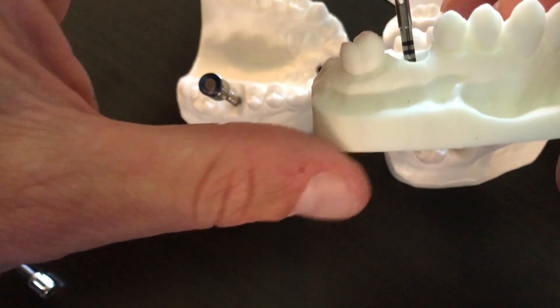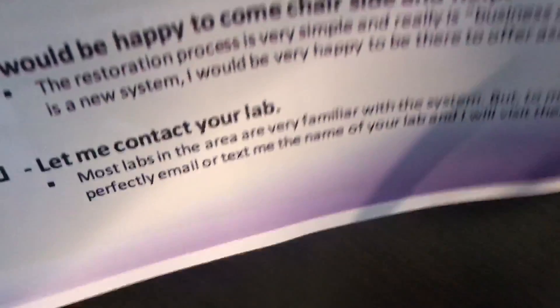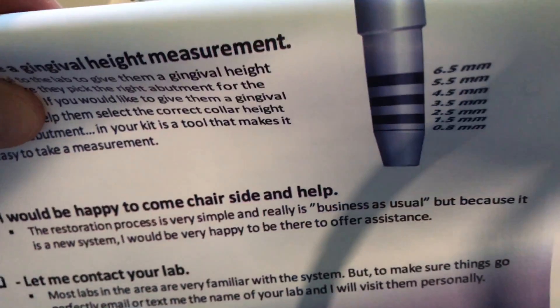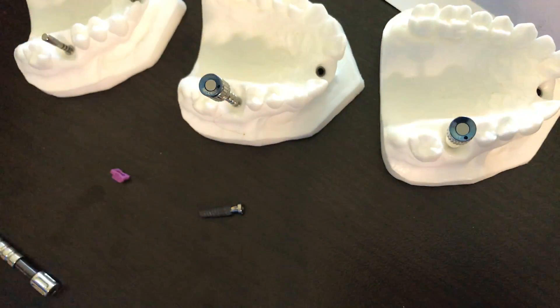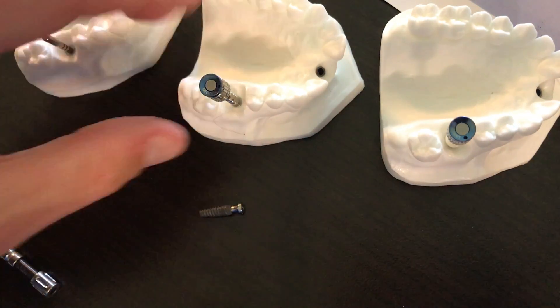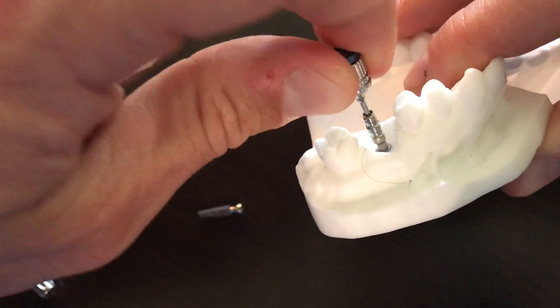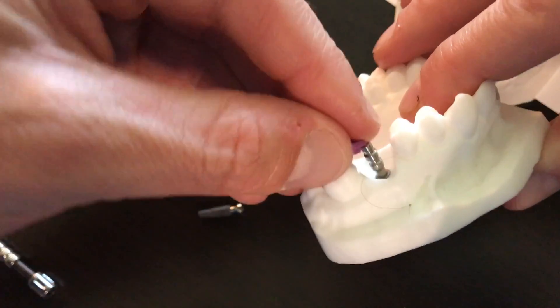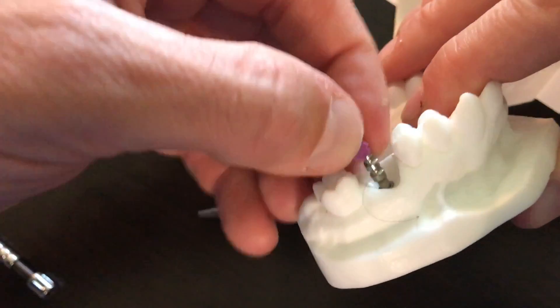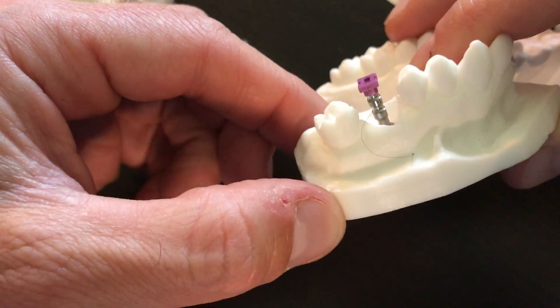We look on the buccal and see where our line is to take a measurement for the laboratory. We let those guys know, counting backwards on the measurement here on the side of this, what that gingival height is on the buccal. Then very simply, in this case in the posterior, this is a closed tray impression coping. We put this on until it gets tight, and it comes with two of these little blue or purple disposable caps — they very easily snap on to the top and are then picked up in the impression.